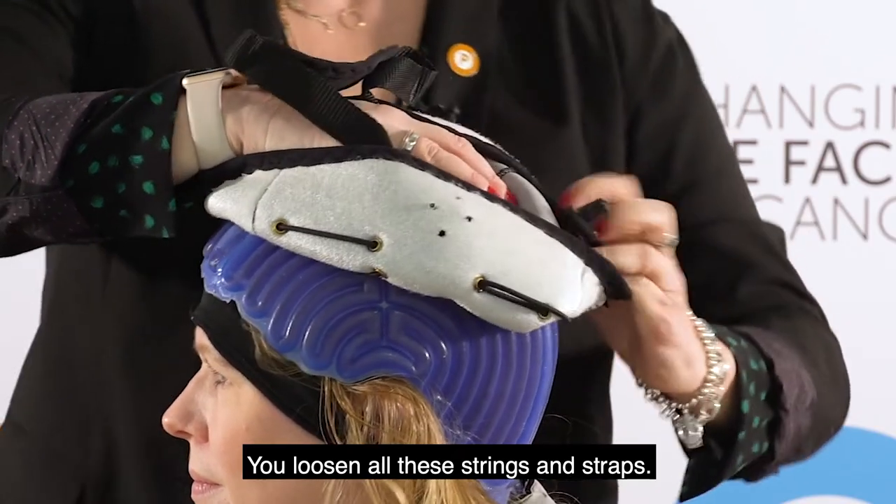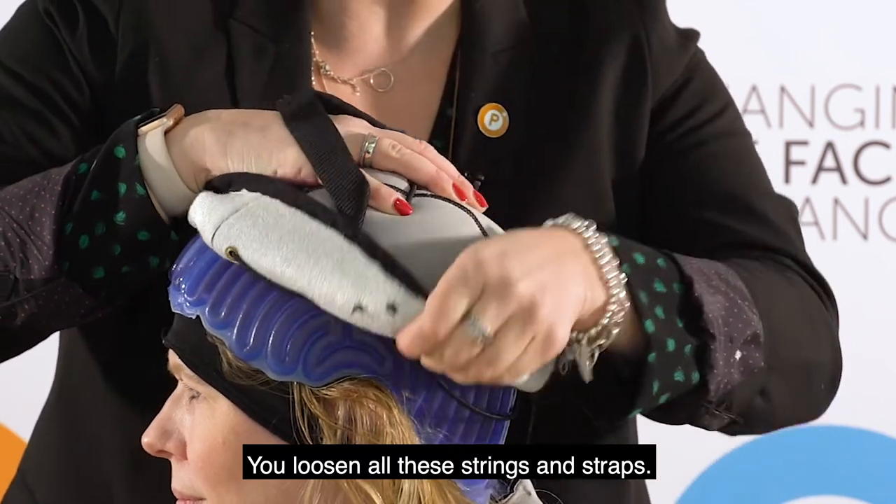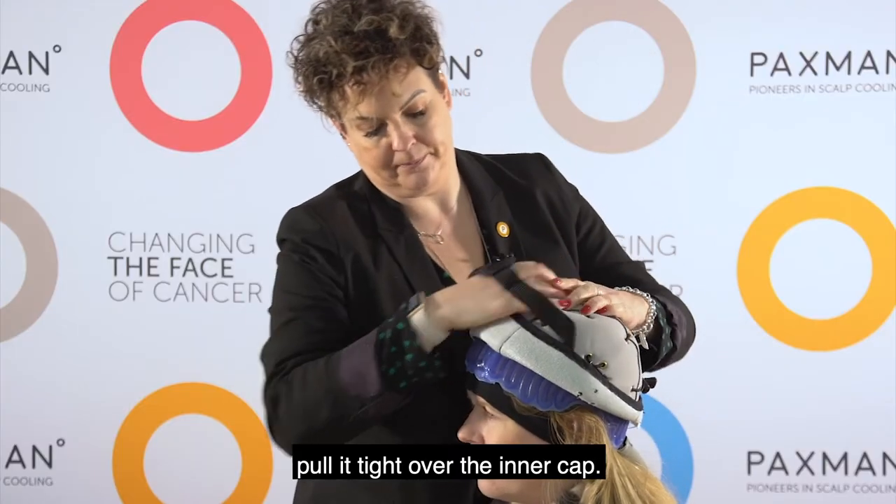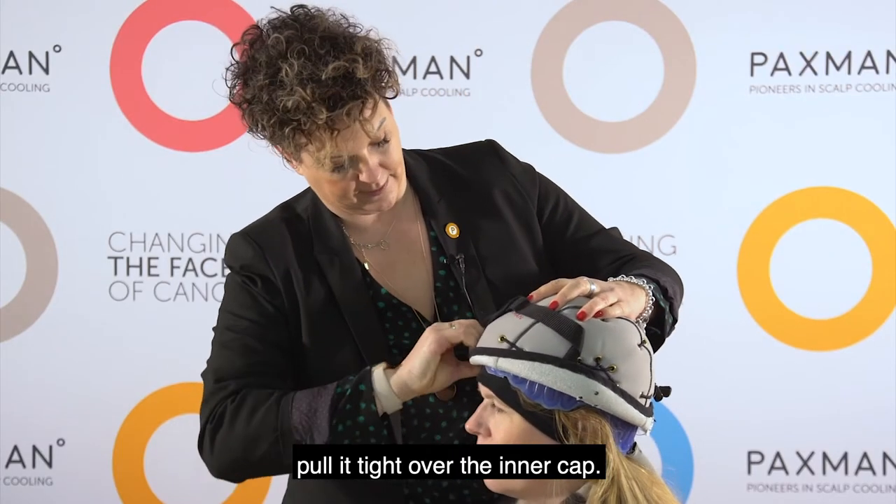You loosen all the strings and straps, turn it inside out, put it on your head, and pull it tight over the inner cap.